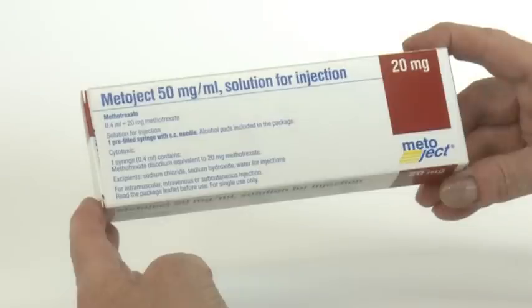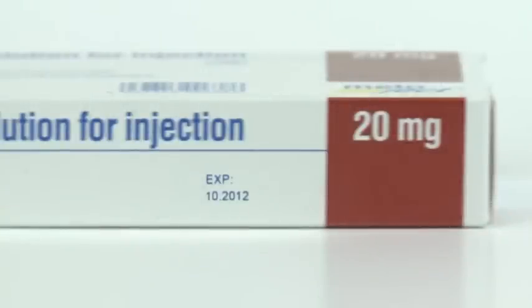Metaject is a pre-filled methotrexate syringe for subcutaneous injection. It has a pre-attached needle. Before administering Metaject, please remember to find a quiet clean area, always wash your hands, and check your drug is in date and is the correct dosage.